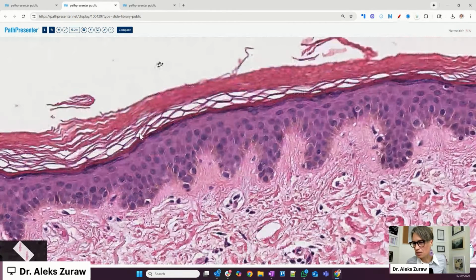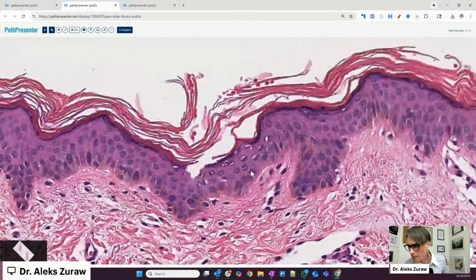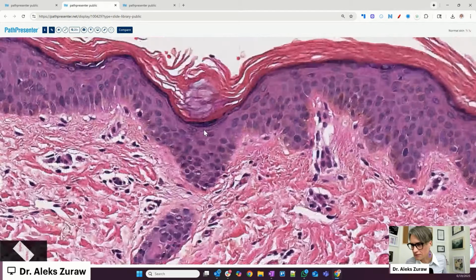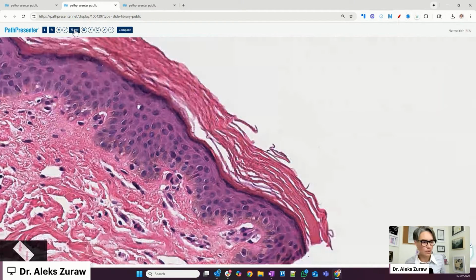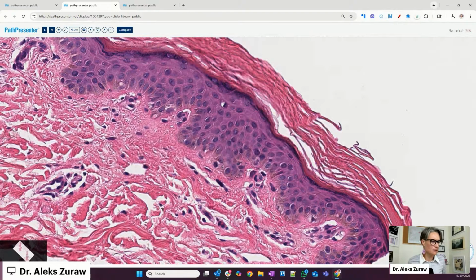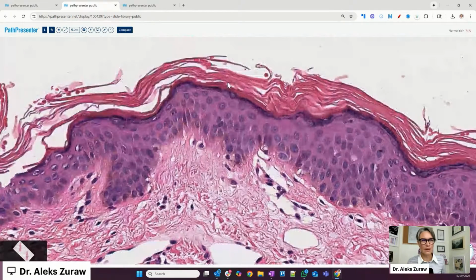If I find any, I'll show them to you for sure. Trying to find some for you. Maybe if we would go to a higher magnification, but for this one we can only do 20x. Okay, I don't see that anybody is seeing the link, so maybe you just don't see it. If you see at some point, click on it and let me know if you can see the slide. Moving on.